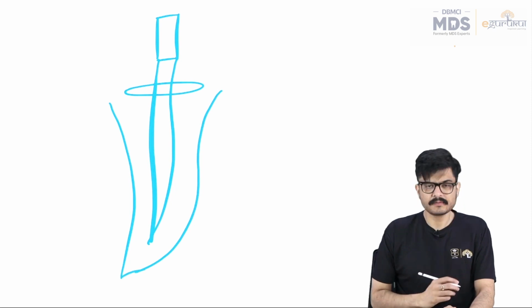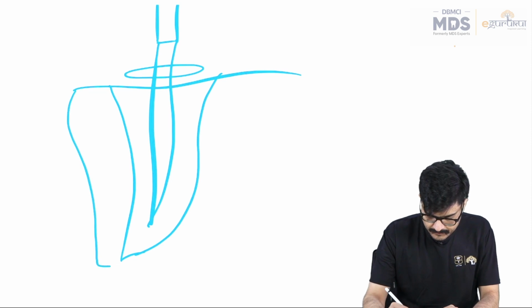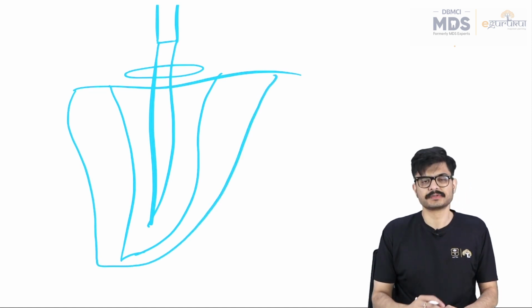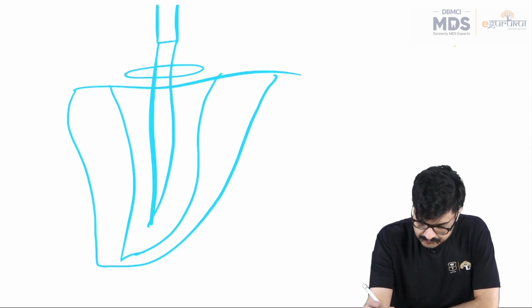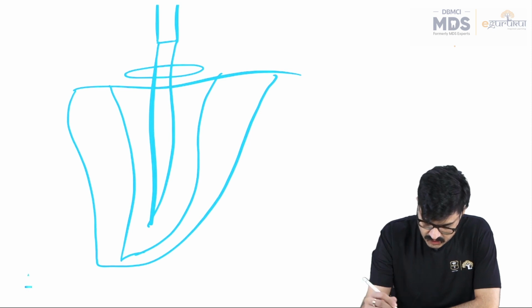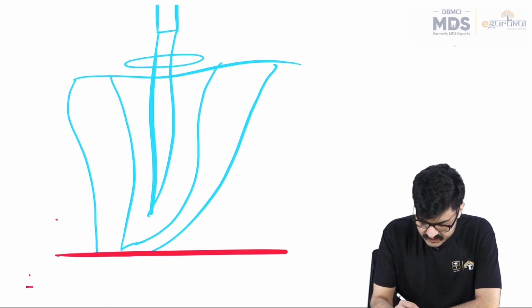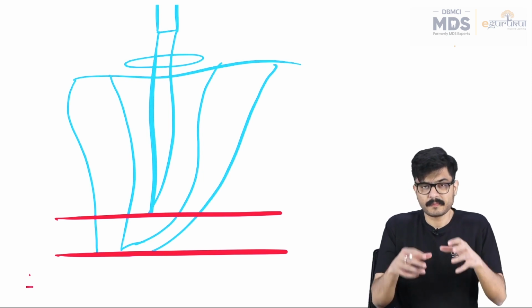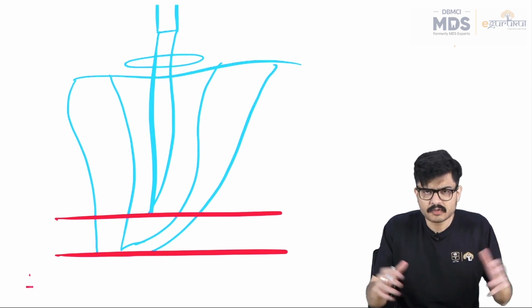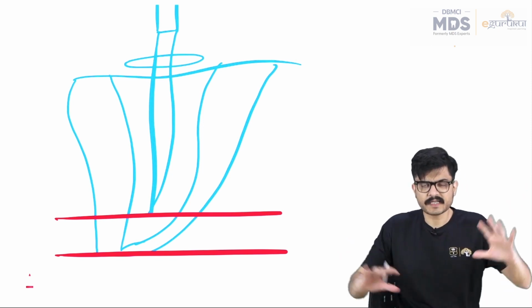This is my root canal, right, friends? This is my root. Now, if this distance was exactly from the apex of the tooth, if this distance was exactly 1 mm, right, friends? Then that means 19 plus 1, 20, I'm perfect. My pre-op X-ray was good. 1 mm short, that's my final working length.